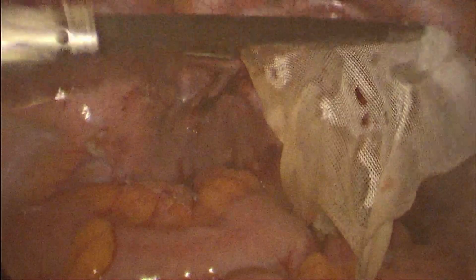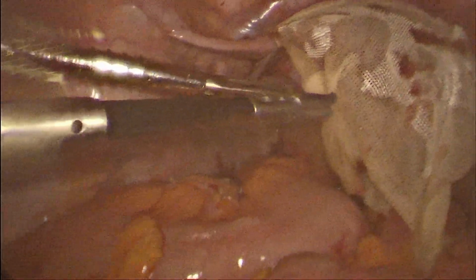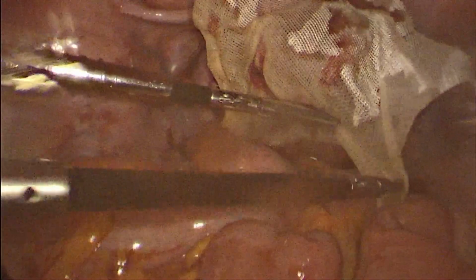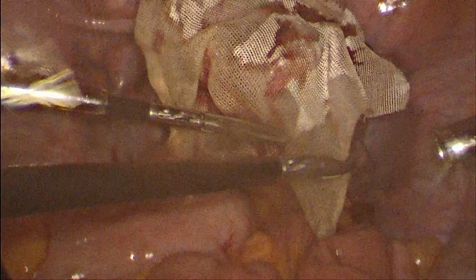To prevent adhesions, we routinely use oxidized cellulose, that is Interceed, to cover the incision.